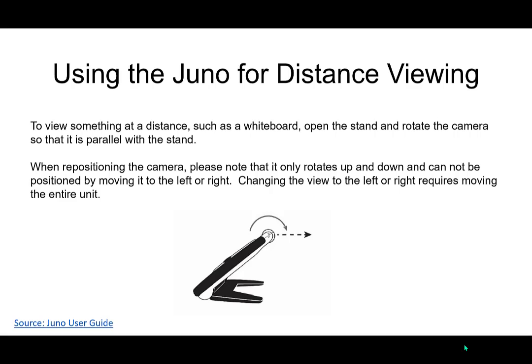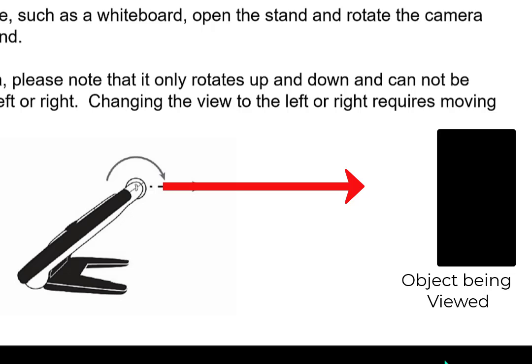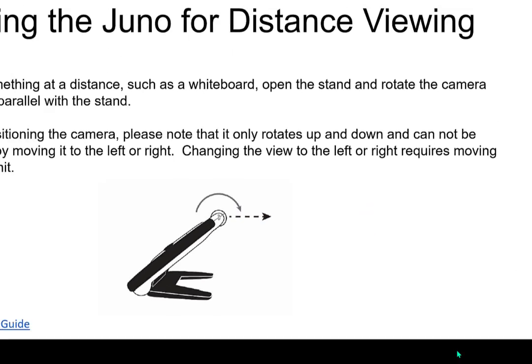You can also use the Juno for distance viewing. There's two different sort of distance and spotting things that it talks about, and this talks about distance viewing. So you're going to extend that stand again and sit that unit at an angle where you can see best whatever you're trying to view at a distance, like a whiteboard or a sign on the wall, a word wall or something like that. And you're going to point that camera where the item is that you're trying to read. Now, please keep in mind that the camera, as before, does not rotate right and left. You're going to need to physically move that unit to the left or to the right to line it up with what you're trying to look at.